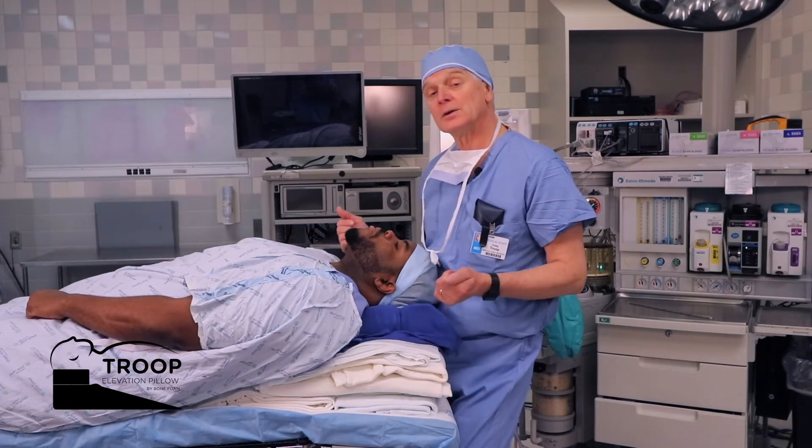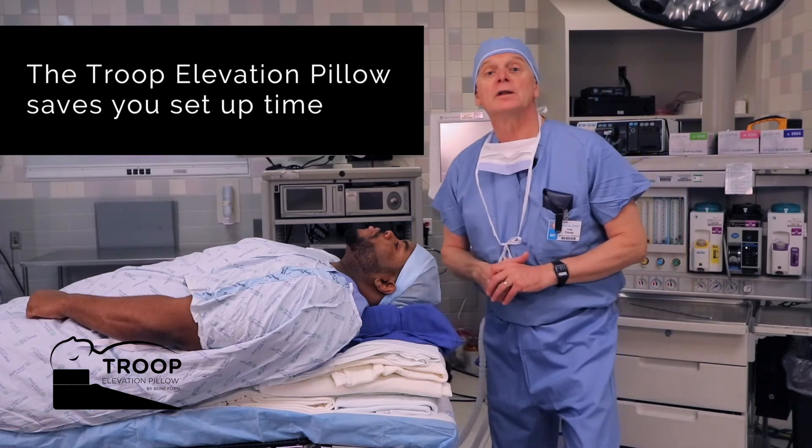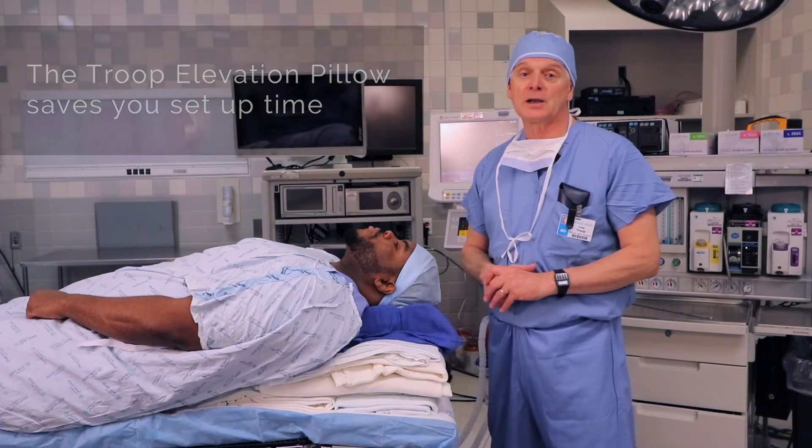Blankets work, but they take too much time. As patients are getting ever larger, the number of blankets required increases dramatically, and you end up with a very unstable platform.